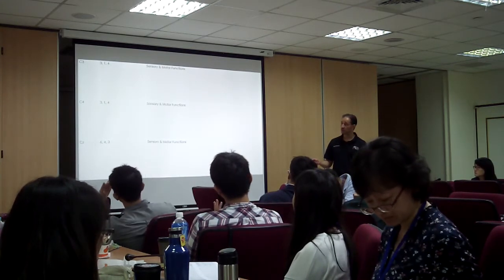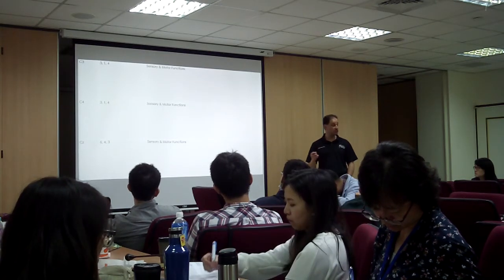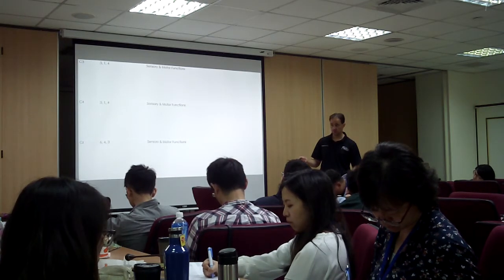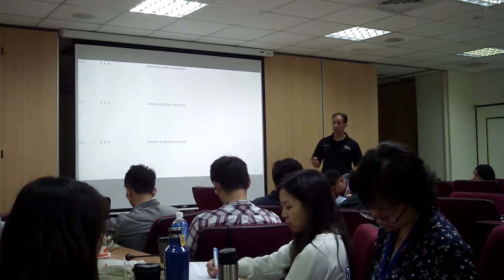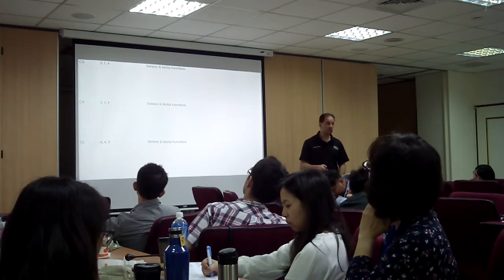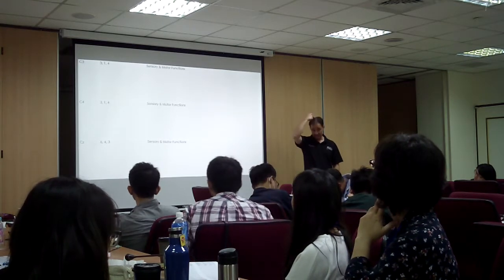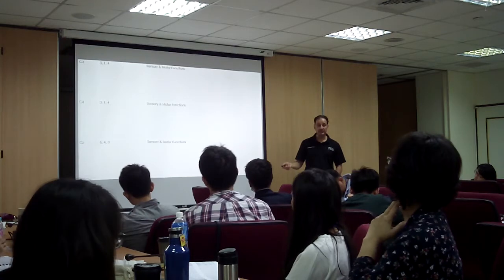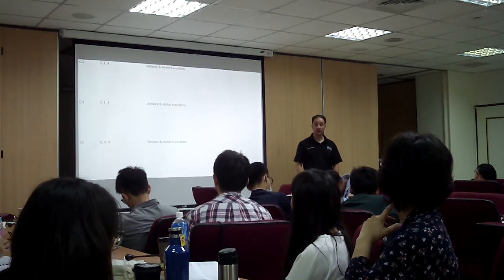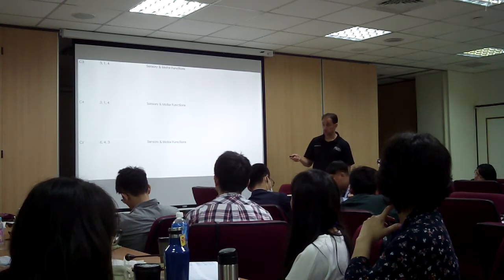C3 and C4 are good for the mu type. If you have mu type ADHD, you're going to suppress the mu at C3 and C4. Now, a general wording here, which I think is valid and important. Sometimes you're going to do theta beta training at CZ with an ADD client, and they're not getting better, okay? Or they're getting worse. And the reason is that they could have mu.